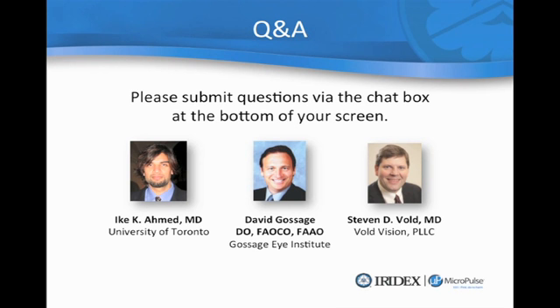and they still had a nice response with 1,000 milliwatts. I did have one patient, actually, I think they just came in yesterday, who's been out probably 6 or 8 months with 1,000 milliwatts of power, and the pressure did rise back up, not quite as high as it was before the initial treatment, but it did rise, and we retreated. So I'm not sure yet how they responded. I'll know more in the next couple of weeks or so, but retreatment-wise, I at least found with the 1,000 milliwatts power, it's much, much less than it would have been with 300 or 700.